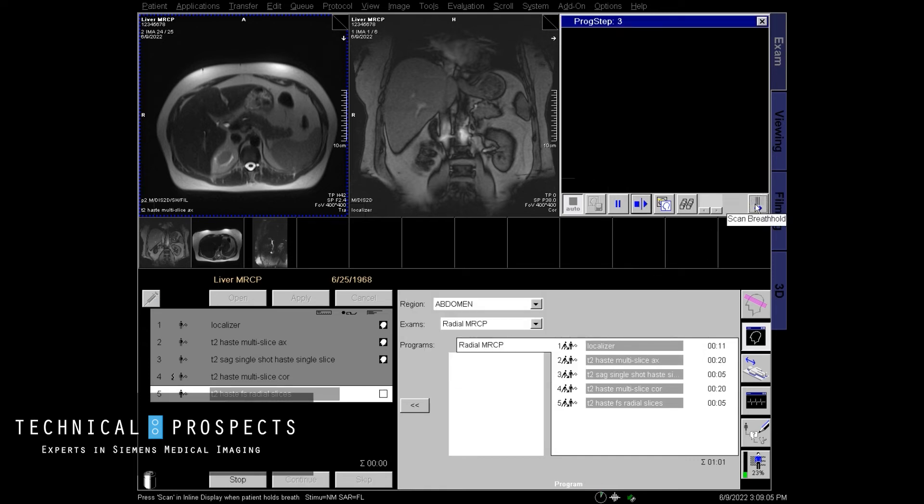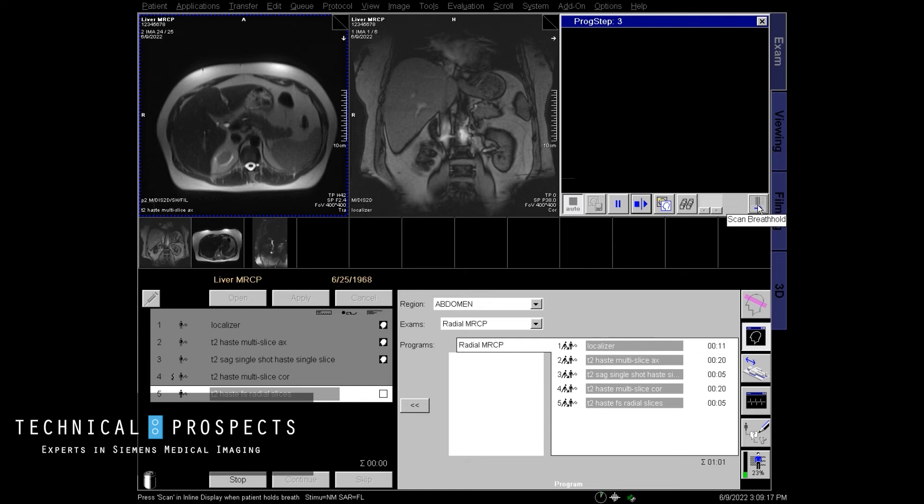And this time we're going to use the breath hold button here in the scan area. This little button here is what we're going to use because we turned on breath hold instead of the other type of breath hold. We always have two types of breath holds. So this is the one that we're going to be using for this.